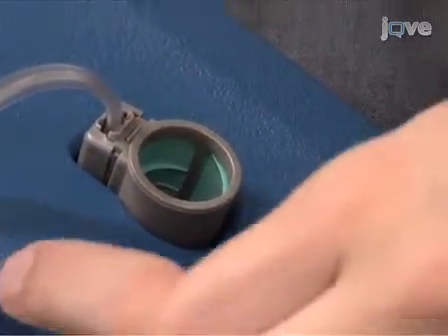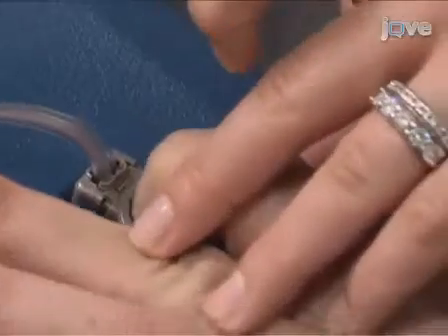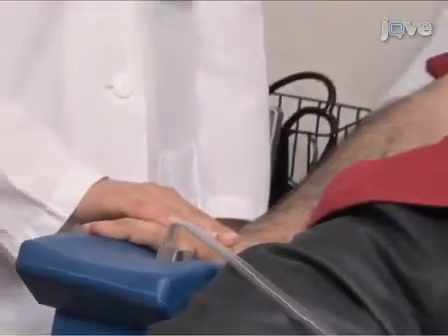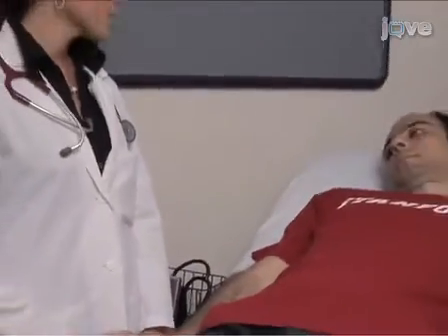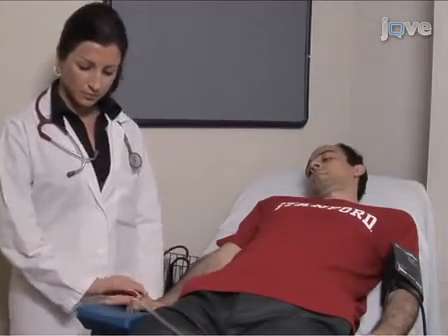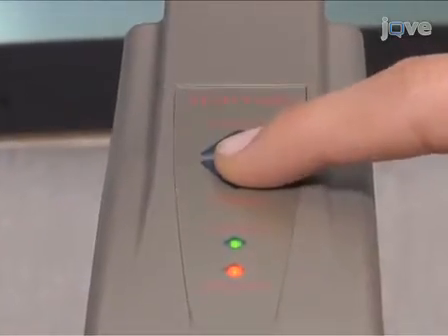Ensuring that it is free from cuts and injury, select a finger, preferably the index finger, for placement of the EndoPAT probe. Make sure the fingernail is appropriately trimmed. Prior to beginning the experiment, ensure that the study finger is put all the way into the back of the probe. The patient should indicate that they can feel the back of the probe with the tip of their finger. After about 5 seconds, push the inflate button on the top of the EndoPAT 2000 device.